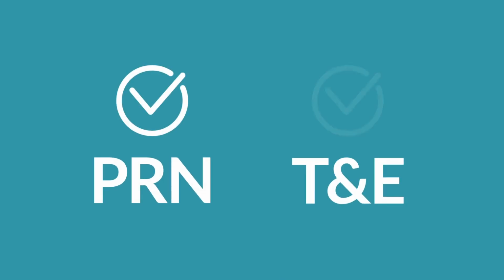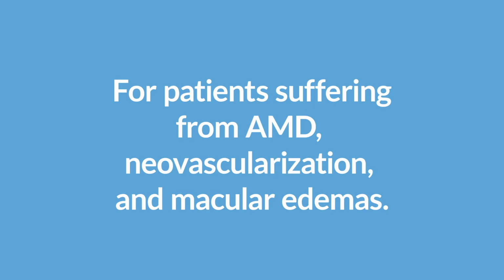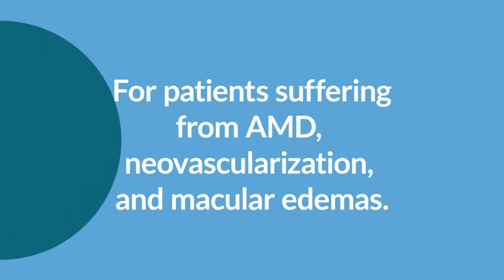Designed to be compatible with both PRN and T&E strategies, the mobile app is especially suitable for patients who require regular vision testing. For example, those suffering from AMD, neovascularization, and macular edemas.